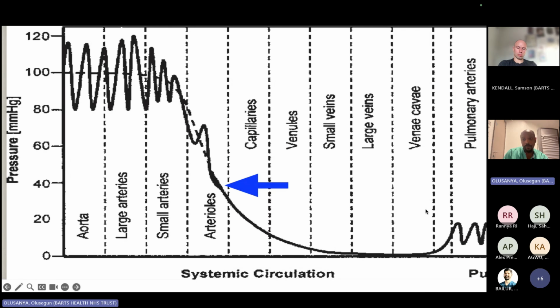So again here, hopefully you guys can see what I've circled here. So remember this diagram here. What VExUS really looks at is this bit. It's the area of coupling between your venous return from your vena cava and your right atrium. And when that becomes decoupled, that is when your VExUS score starts to rise, and that's when you start to see this sonographic evidence of venous congestion.